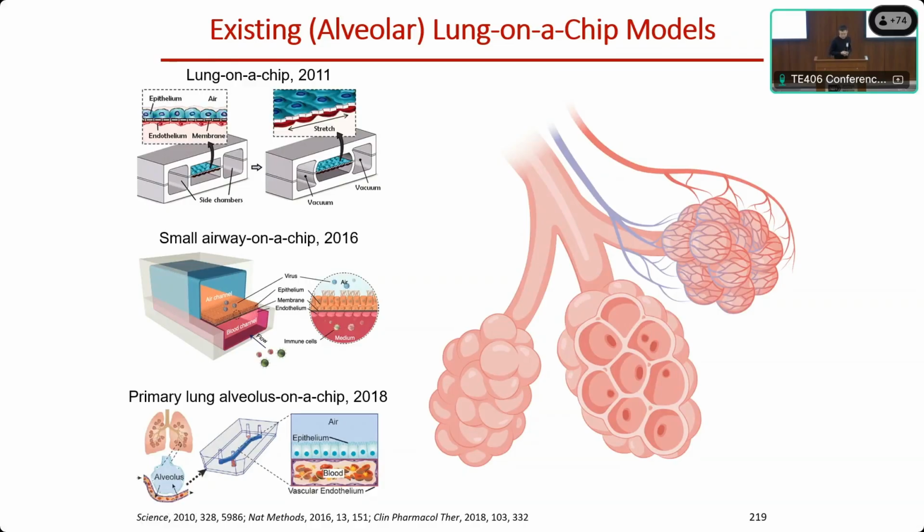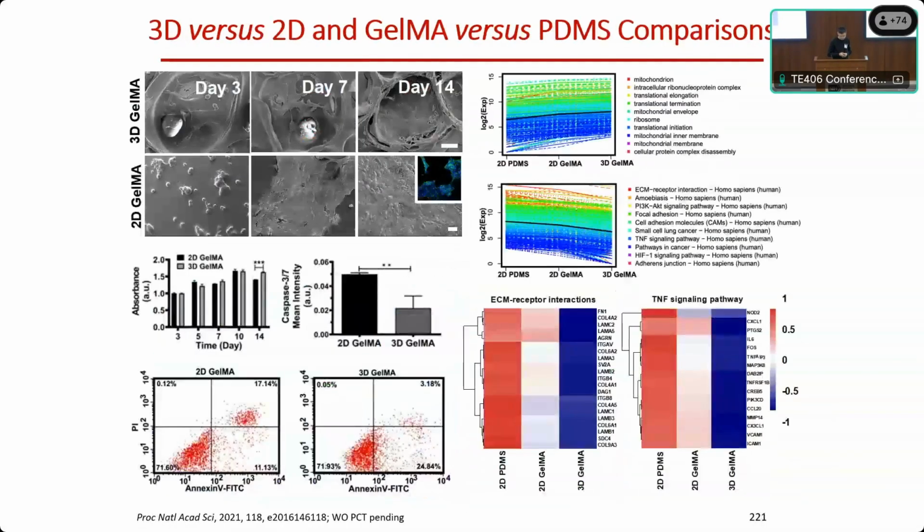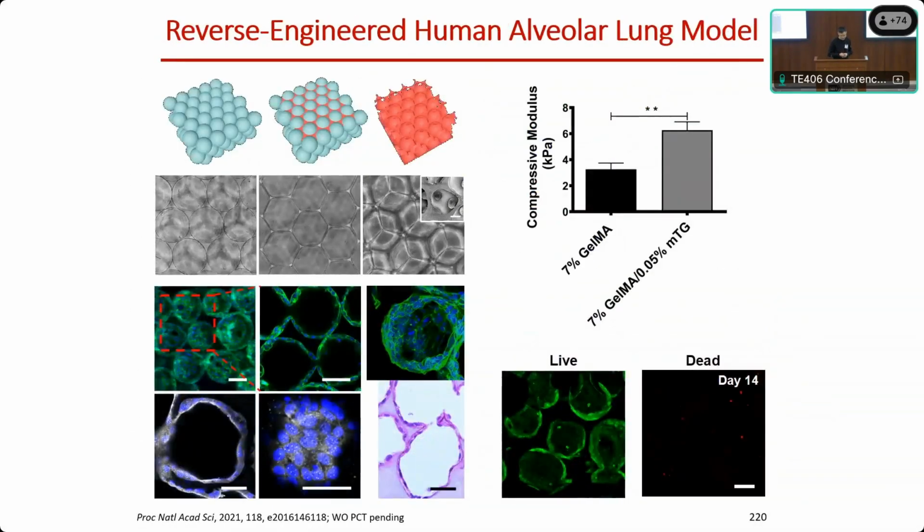What we were working on, which is the basis of this project, is that a few years ago we designed a system called an inverse scaffold device, which has an interesting structure made by a templating process. You make particles to begin with, put them together into a lattice, and infiltrate the scaffolding material between them.